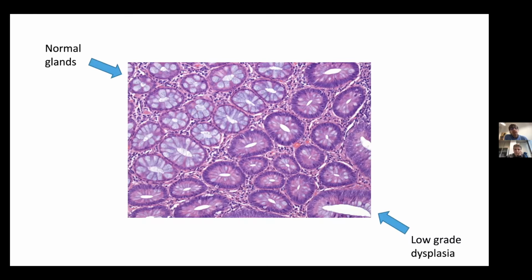It changes the kind of nuclei. You can see here on the basal layer, these nuclei which are more evident, more dark compared to this kind of small round nuclei. And in this case, I would say that there are no other major differences. Probably if we had another image, you would see also some other characteristics. But anyway, this is the kind of the problem.